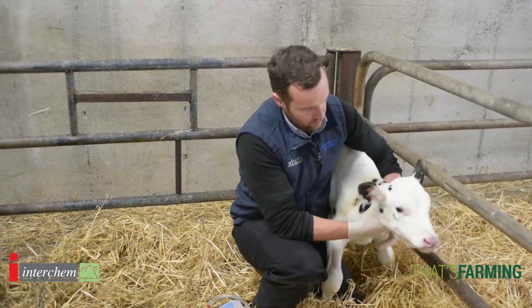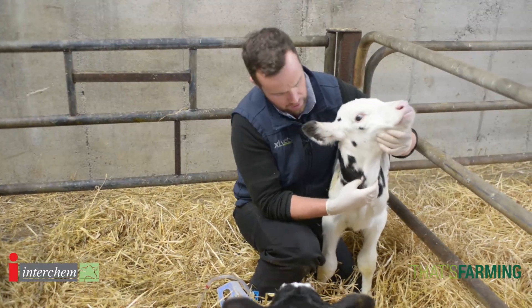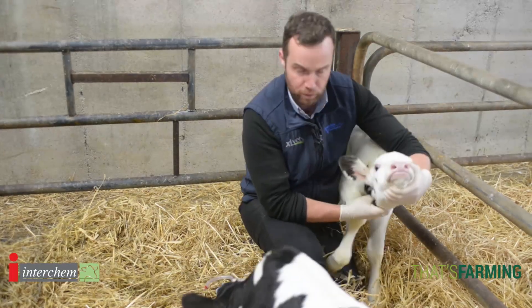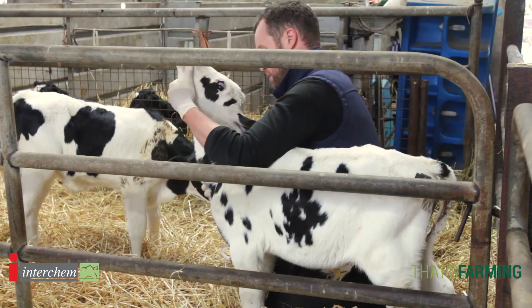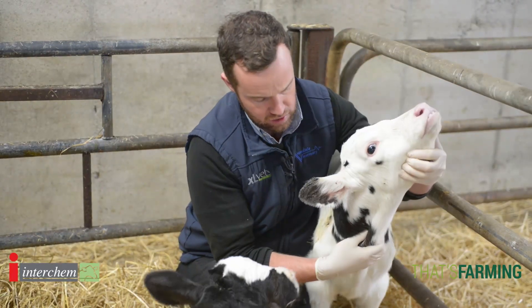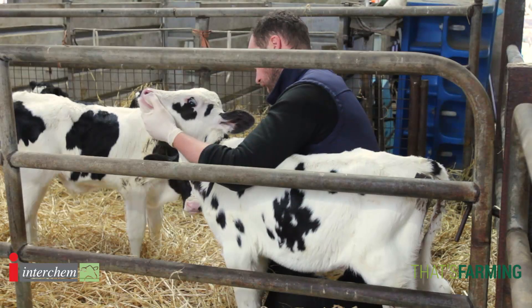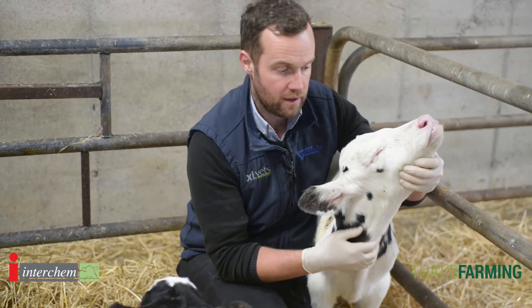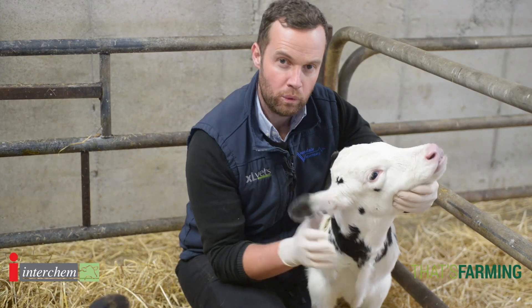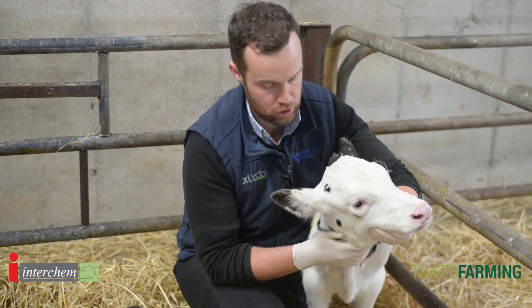One thing I like to do before I ever put a tube in is to feel the calf's neck. When you feel a calf's neck before you put the stomach tube down, you'll feel the windpipe — it's like our own windpipe, it's got the rings on it, and it's just a useful guide. When the stomach tube has been placed, you'll actually feel it lying to the left of the windpipe. I use it as the two-tube rule: when we know that we have the windpipe and the stomach tube separately, it's safe to pour. It's a very useful little trick that I've always found when stomach tubing.